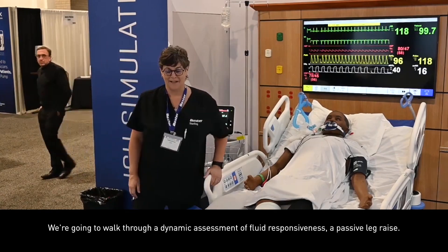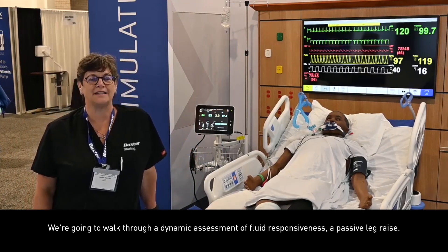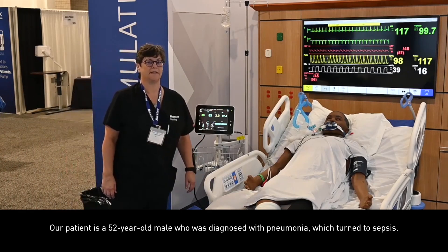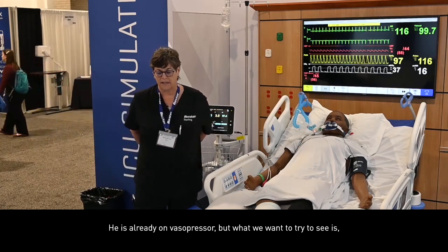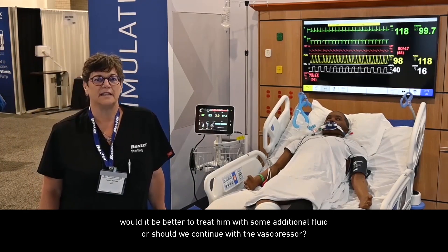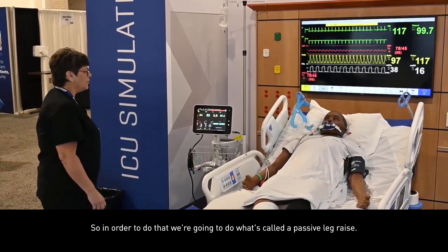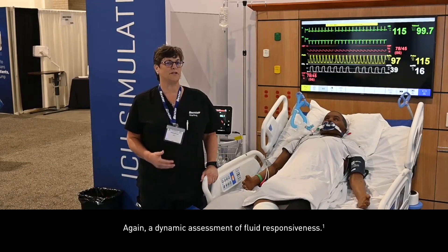Hi, we're here live from the NTI. We're going to walk through a dynamic assessment of fluid responsiveness — a passive leg raise. Our patient is a 52-year-old male who was diagnosed with pneumonia which turned to sepsis. He is currently here and his MAP is a little soft. He's already on vasopressor, but what we want to try to see is whether it would be better to treat him with some additional fluid or continue with the vasopressor. So we're going to do what's called a passive leg raise — a dynamic assessment of fluid responsiveness.